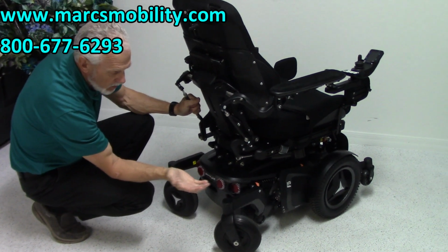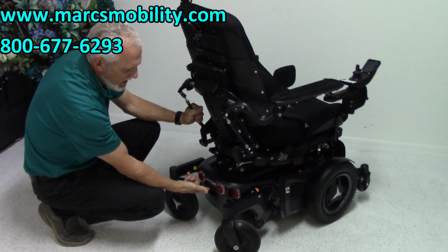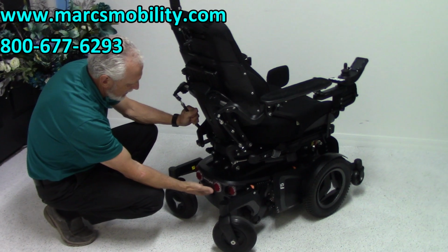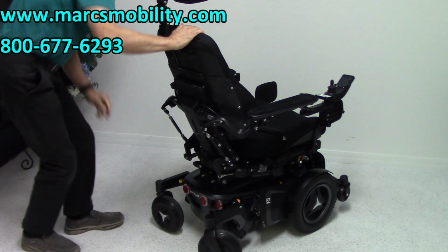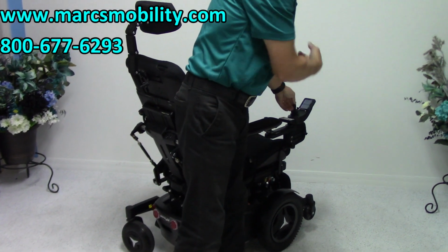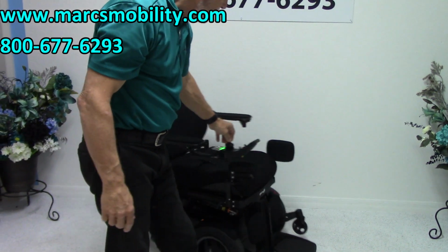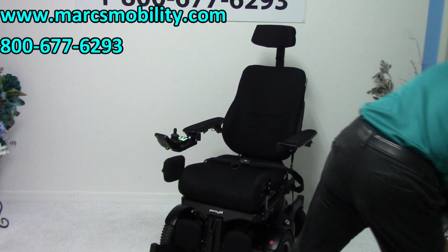I just turn the power off. Power is back on. We will turn the power off right here when we ship these chairs to you. So the first place you need to go is back here. Turn the power on, okay? Whenever you turn the power off in the back, it turns the power off in the front. So you have to go to the front and turn the power back on in the front.